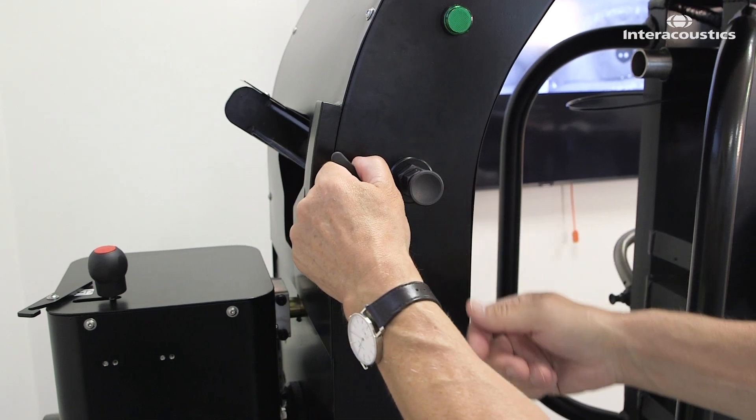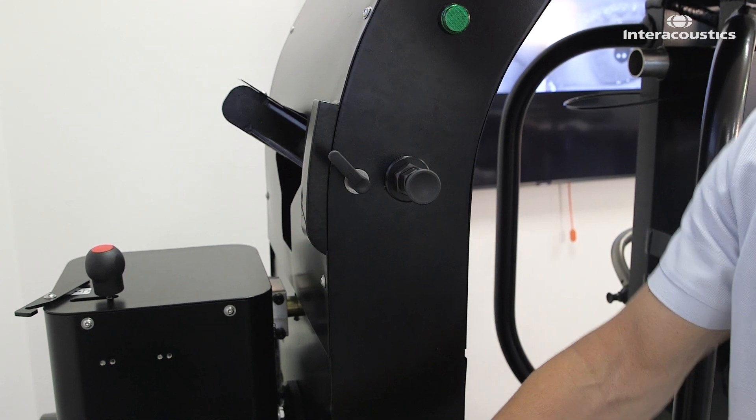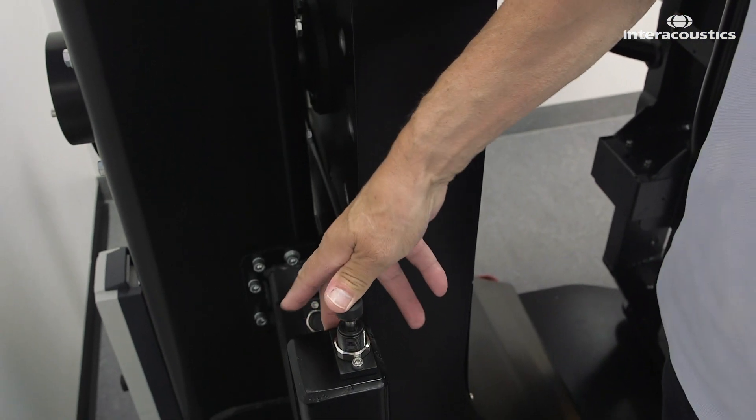First, lock the augmented stop arm in a 45-degree upward position where it will collide with the upper shock absorber.